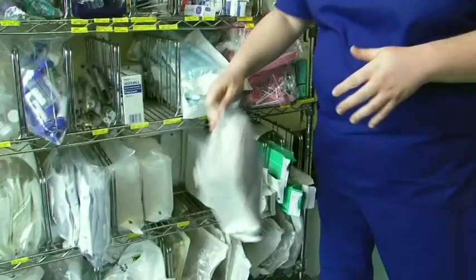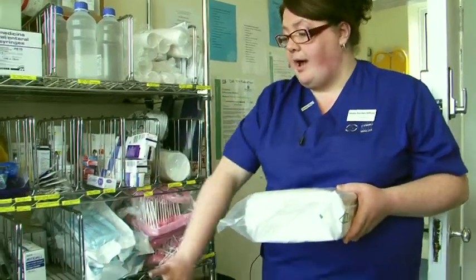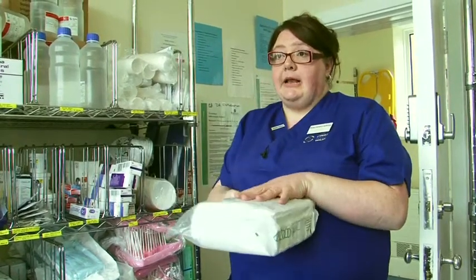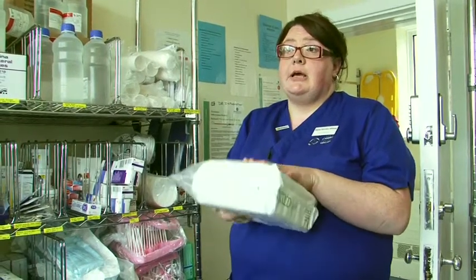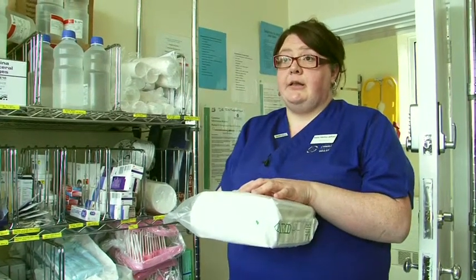These are the catheter packs. In here is all the equipment that you need to catheterise a patient. Previously, it would be everywhere. The catheters here, your bags, and also in the other room. But in here are your aprons, your gloves, your lubricants, materials to wash the patient, your sterile fields, the catheter. And the catheter's also attached to the catheter bag, so you don't need to break the seal, which could introduce infection. We've now got standardised care, which is based on good evidence.